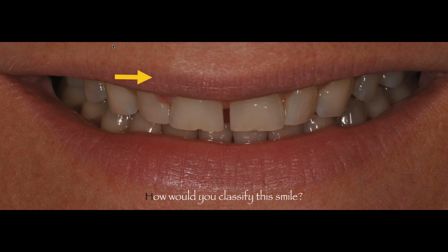We can all as well see that the patient has some very distinctive wear on both central incisors. So at this point, I can be thinking, would there be an occlusal issue that would be causing this type of wear on this patient? Do I need to examine the occlusion of this patient to come up with a treatment plan?